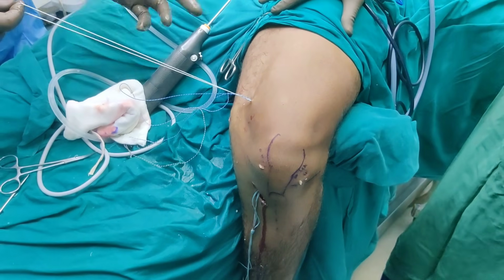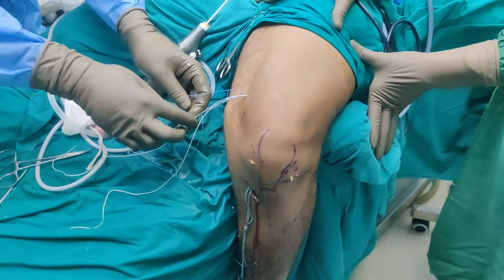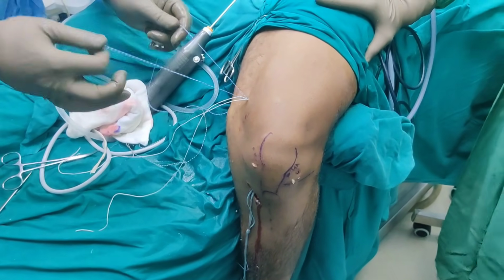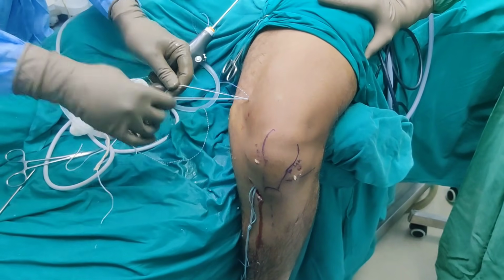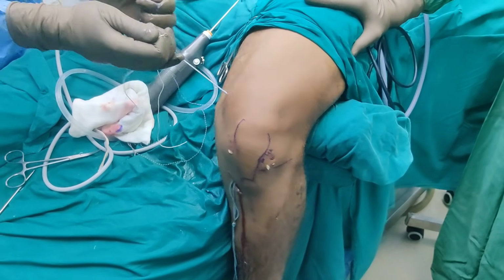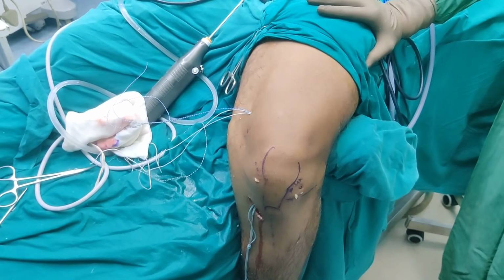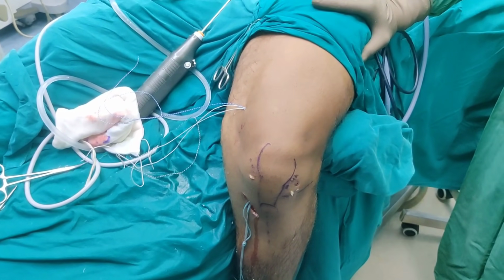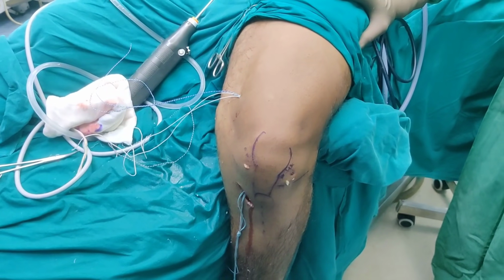Now if you're using a sliding loop, then it's not a problem. For a fixed loop, this is a problem because your tunnel has to be perfect. So once you think that you have flipped this, both sutures will become free. So this is free, and now this will give you a rocking movement. So this is flipped. So it's all done. On this occasion, we were very lucky that we didn't have any struggle, but this can be a point of great struggle, especially if you're using a fixed endobutton.